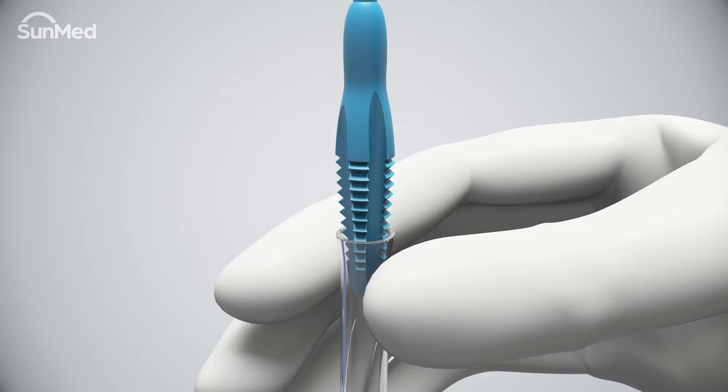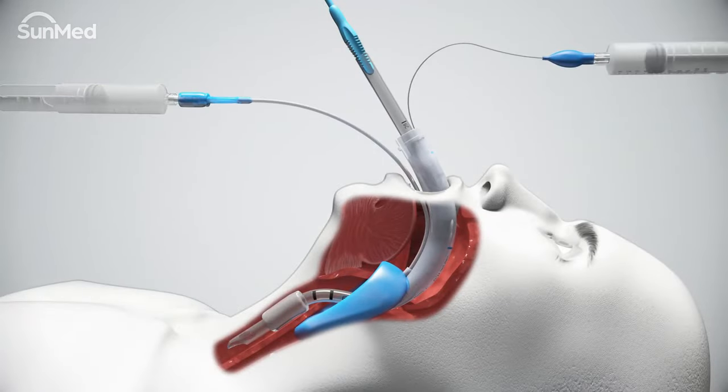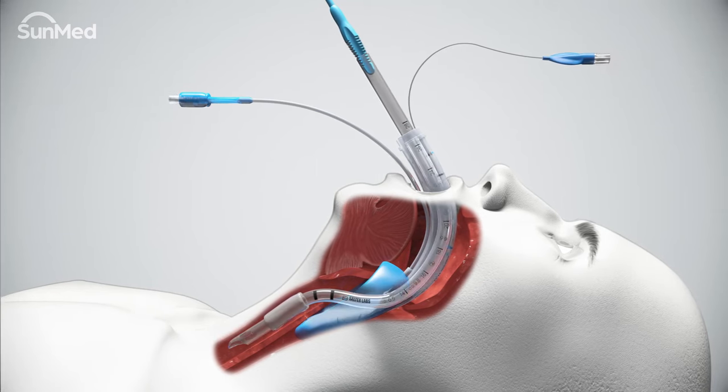For air Q3 airway sizes 0 to 1.5, simply push the stylet firmly into the endotracheal tube. Fully deflate the air Q3 cuff and pilot balloon. Deflate and lubricate the endotracheal tube pilot balloon before withdrawing the air Q3 airway.